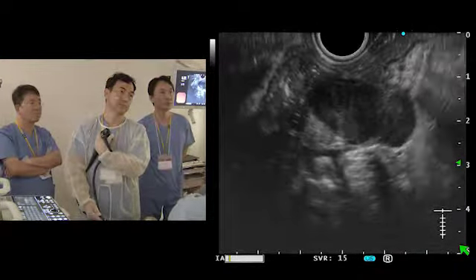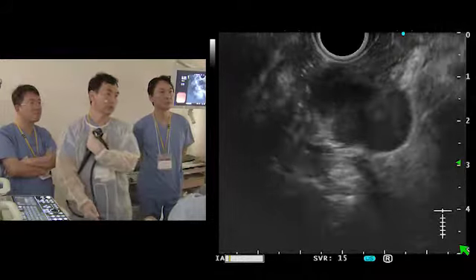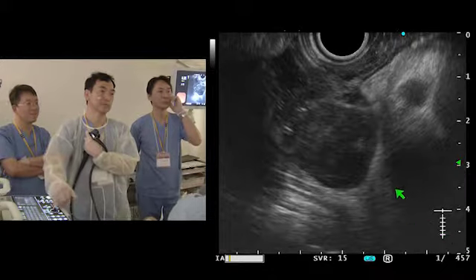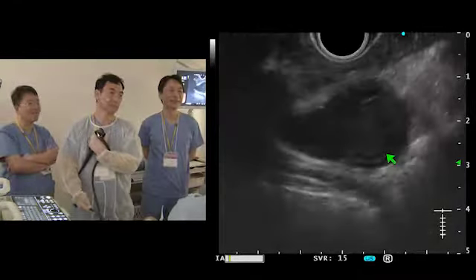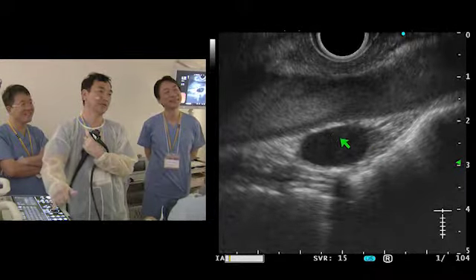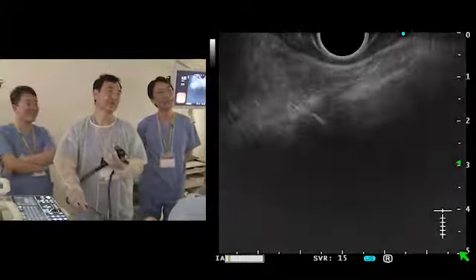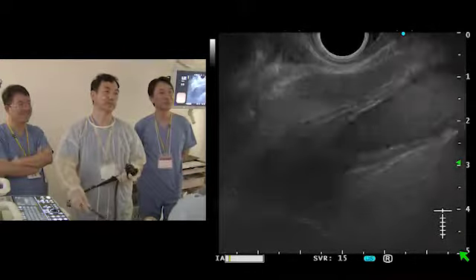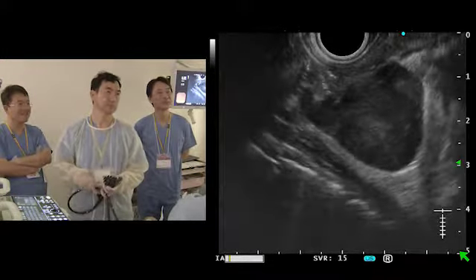Yeah, we can approach with a submucosal tunneling approach, STER or POEM. When you do STER, can you go really close to the heart? Yes. The esophagus is always close to the heart. How about the aorta? There's a very thin separation from the aorta to the tumor. Yeah, it's okay. The esophagus is always touching both the atrium and the aortic surface. Of course. So this is an encapsulated solitary tumor.